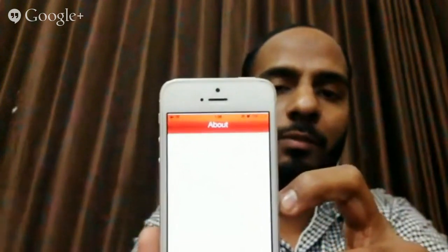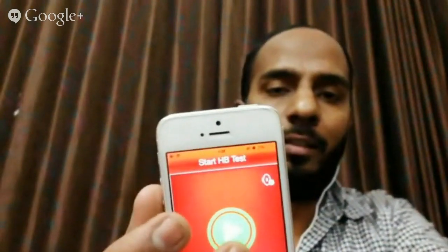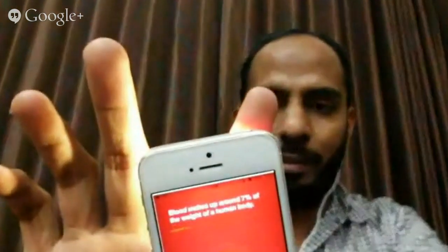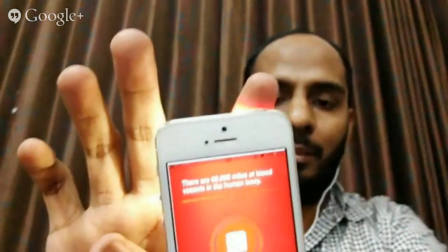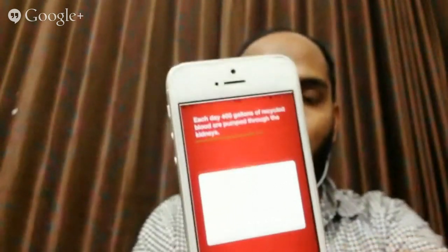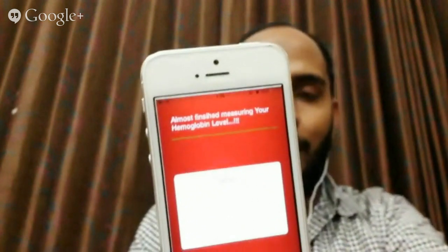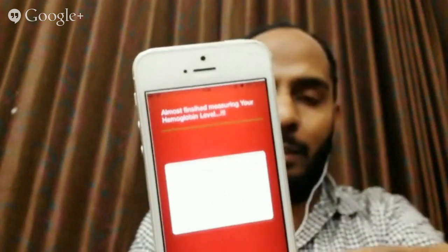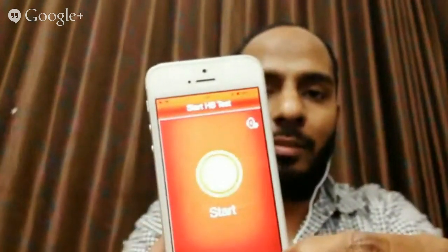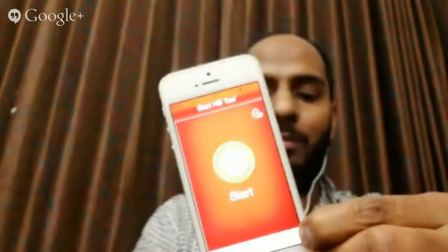One more important thing: if you do not keep your finger properly, the app will give an error. I've kept the finger partially covering the camera, and the app detects it and gives a message: 'Oops, your finger is not placed properly.' So if you want a good reading, make sure you keep your finger cleanly and properly on the phone, and make sure your finger does not have any chemical or paint on it.